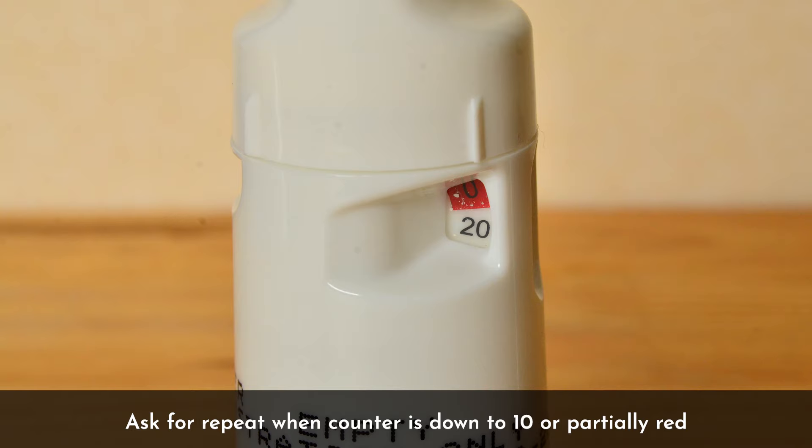Once you get down to around 10 doses, this window will become partially coloured red. When this happens, you'll need to go and get a repeat from your pharmacist or a new prescription from your doctor.